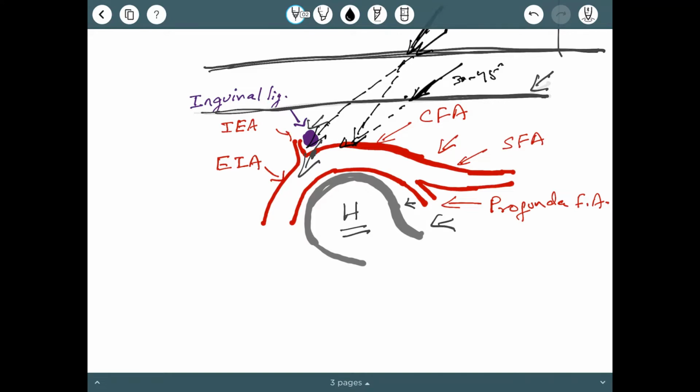But the problem is that when you do a puncture at a very vertical angle, the sheath that you insert can get kinked, and there may be oozing around the puncture site, and obviously it will lead to hematoma. Additionally, it can create problems with tracking of devices through that sheath. So this is the trouble.